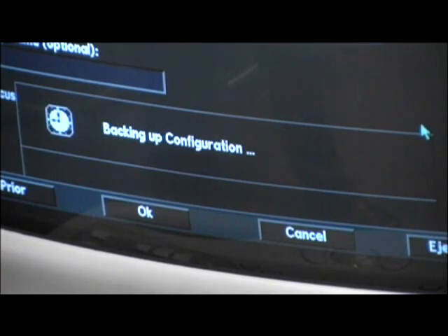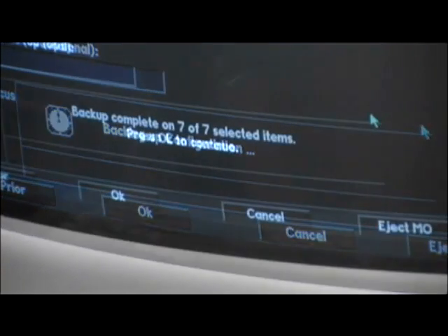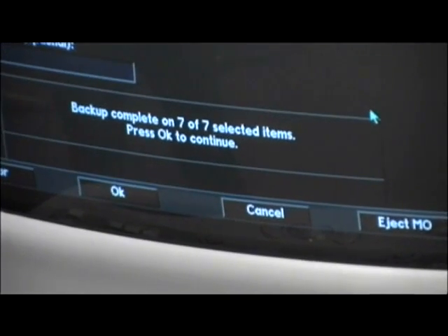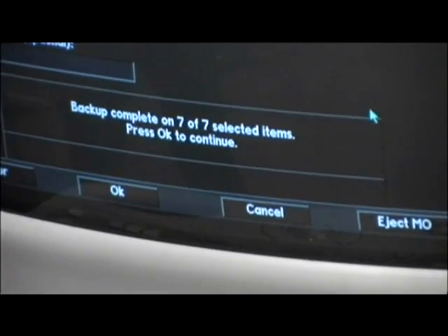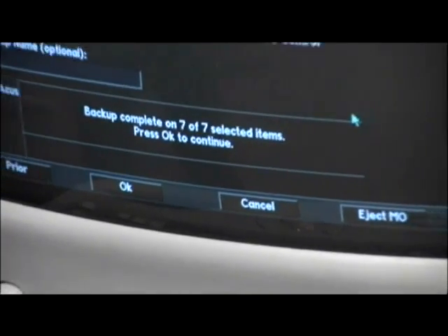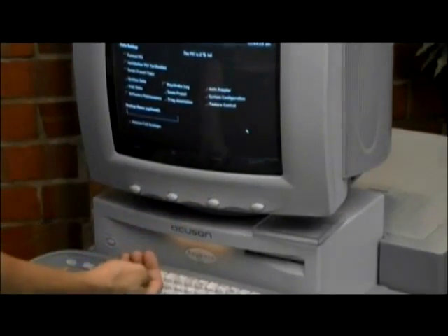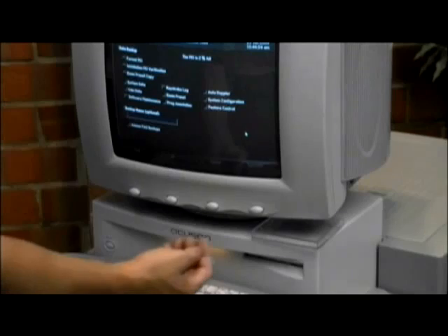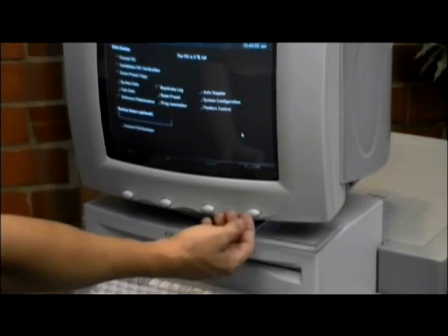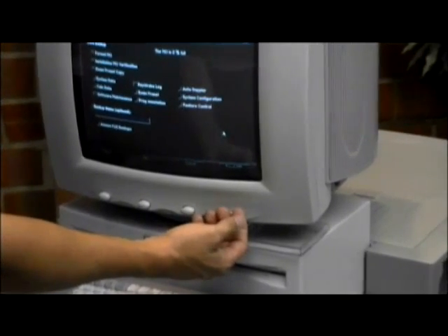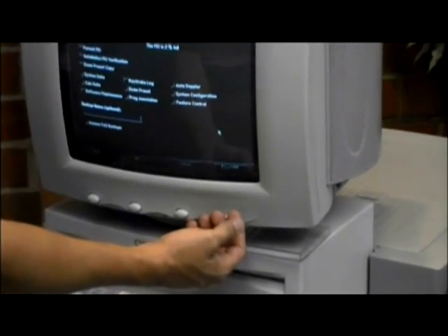Once the backup is finished, the box at the bottom of the screen will indicate completion. Press OK to continue. After clicking OK you will be prompted to eject the MO disk. Press the button on the far right of your monitor located below the screen.